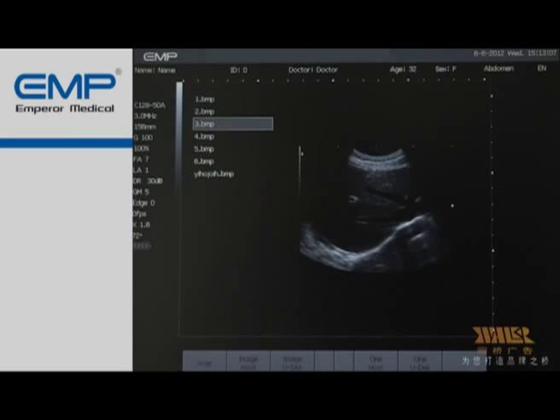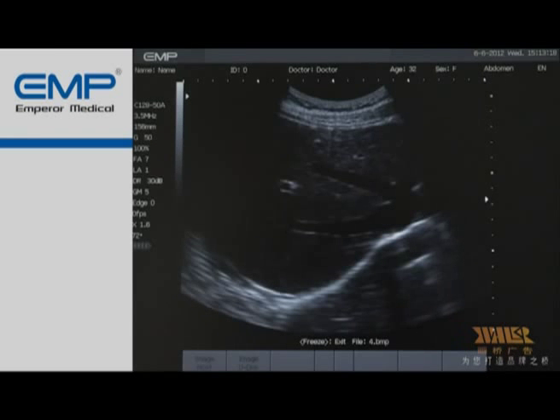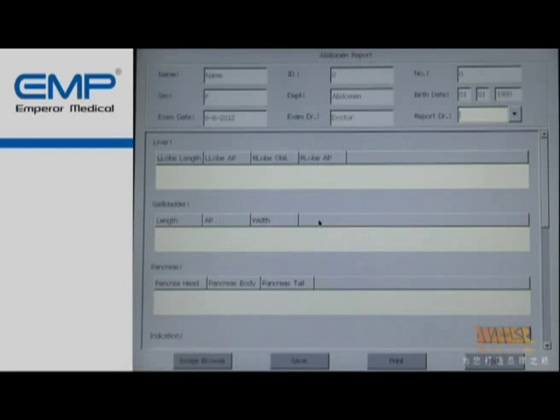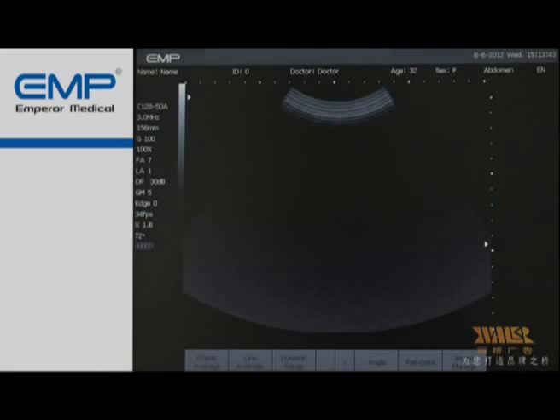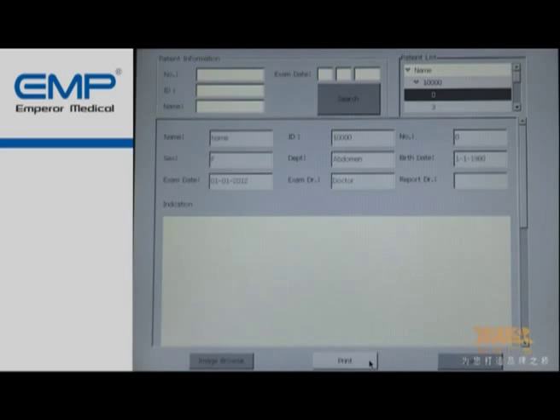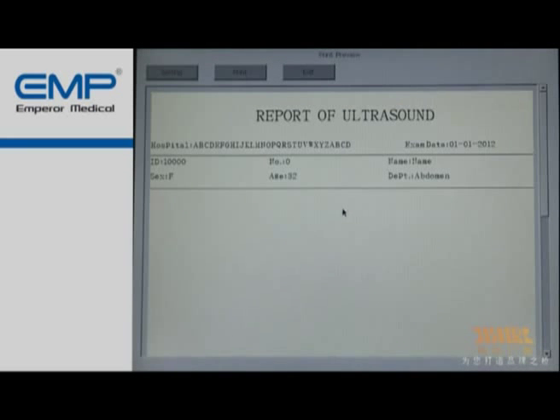Press Load, displaying this menu on the menu area. Press F1 to F6 to load images from different sources. While in real-time image, press F5 to enter the page of patient data, PAT data. In the patient's information selecting area, please enter the patient's number, ID, or name by hand, and then press the Select button. Examine information will appear in the indication area. Press the Browse button to browse the examined image. Press the Print button to print a report.